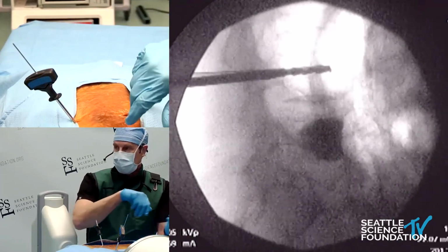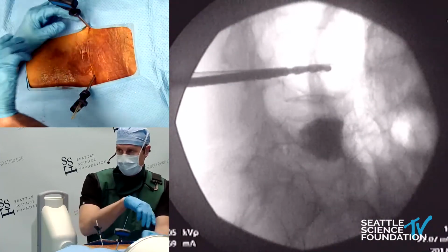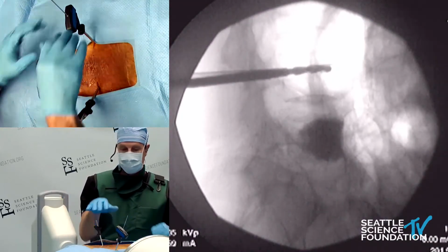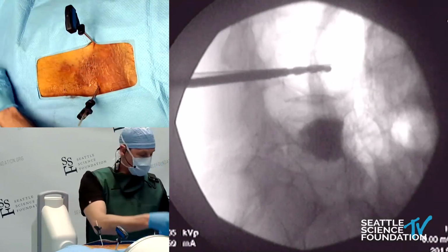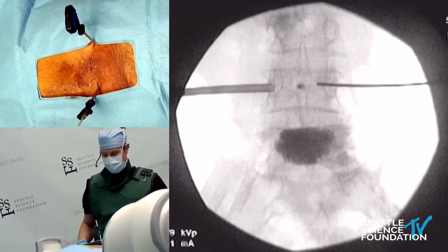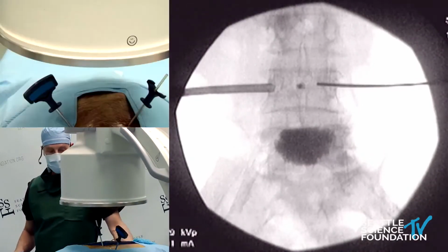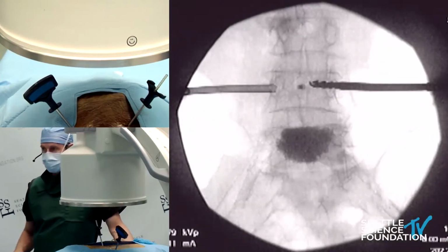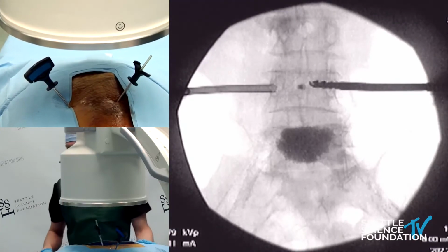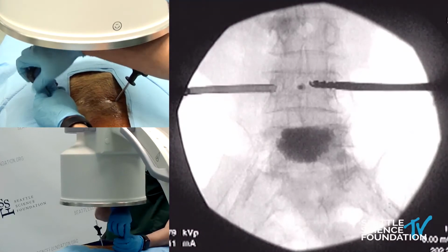I can imagine that we will be in a little bit better position and have that tip just a little bit more medialized, symmetric on the back. The tip looks fine. Let's go around and take a final AP shot of this. And these are size matched, so that will be where the final position of the 5.0 spine jack will be. And so we can compare that with this, and we are more medialized with just the movement and a little bit of consistent, steady pressure while rotating on the reamer. All right, so this comes out, and let's go back lateral.